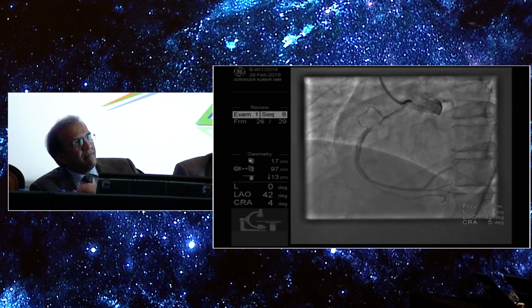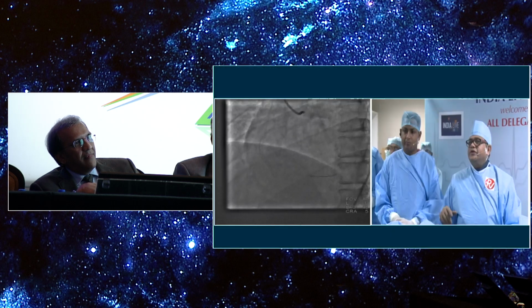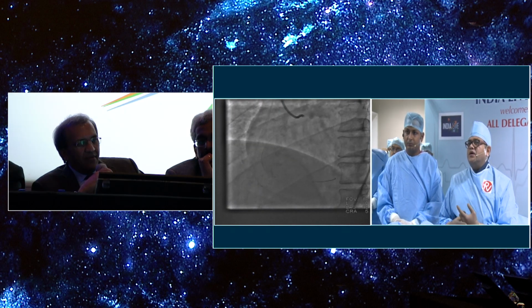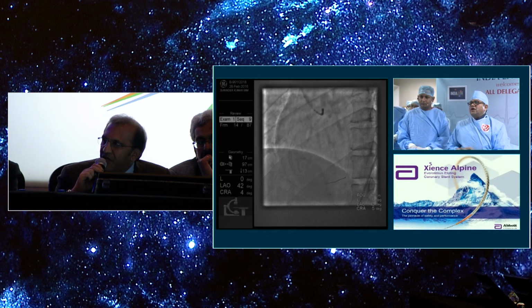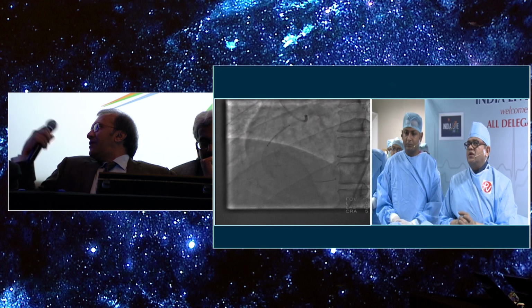This was how much? Show me the last shot. This is how much? 15. So we'll go with the 2.5x18 or 20. 20. 2.5x20. We're cross-talking between Kochi and Chandigarh. I don't know what has happened. 3.5x28 in the proximal.